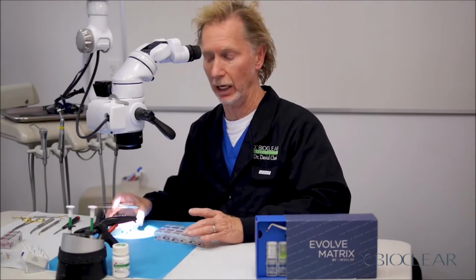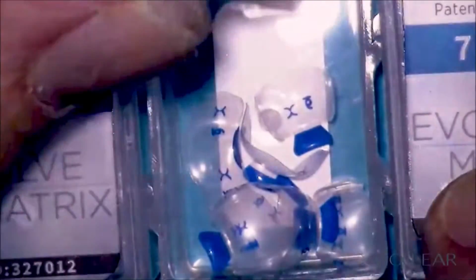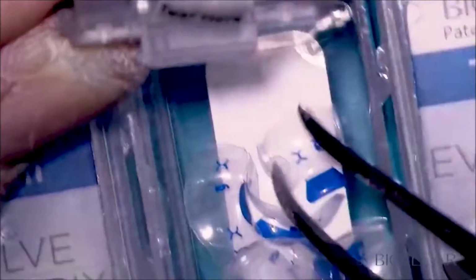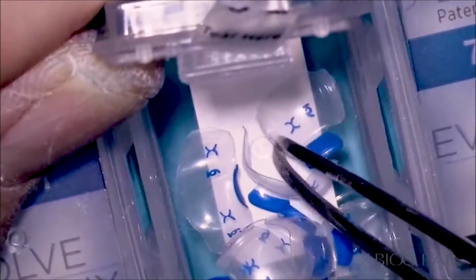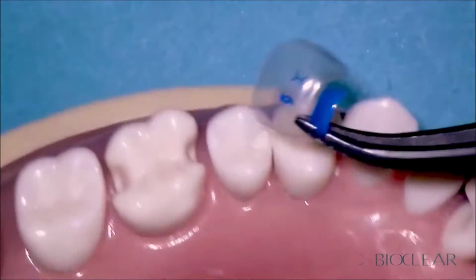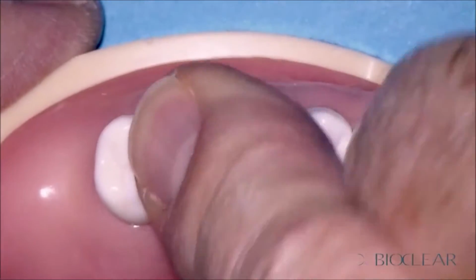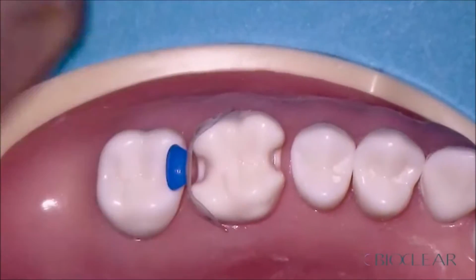Now my go-to matrix with the Evolve matrices are the blue. They have a significant amount of curvature, which we want most of the time. I'm going to grab one of the blue 6 millimeter matrices, and we'll go ahead and seat that in there. And it should be a nice fit. We're going to go ahead and take the matrix, and we will rotate this matrix into position, just like that. I'll drive this down. And let's take a look from a side view, and you say, that's a great matrix.